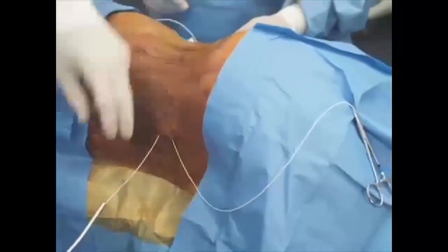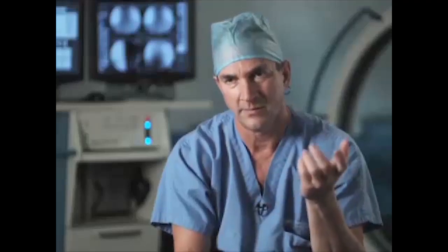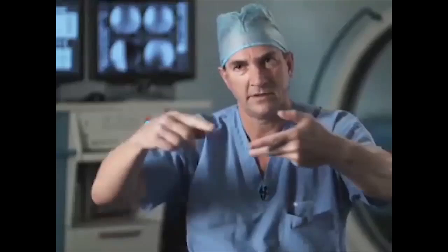And what that does is it prevents me from having to make a separate incision, which of course introduces pain and a new site of a potential infection and so on. So I'd rather not make two tunnels. And most of the time I can do that. I actually reach into the pocket and try to feel the tip of the tunneler as it's pushing through, and try to guide it from the spine to the pocket with a two-handed technique.